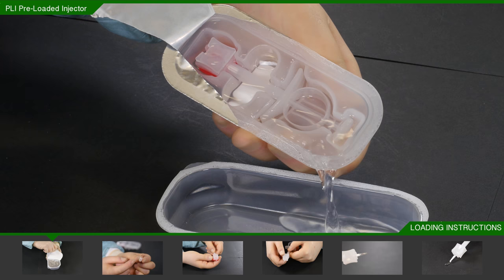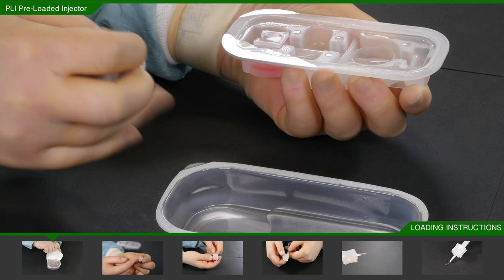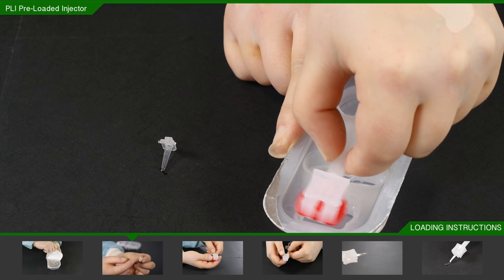Fully retract the foil and remove the PLI from the inner tray with the red nest facing down.